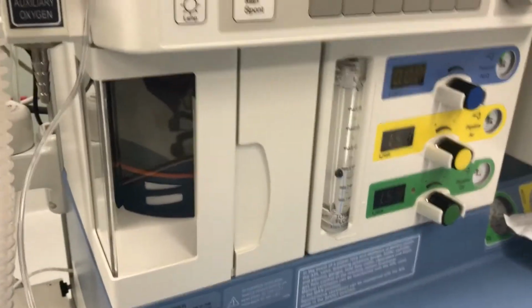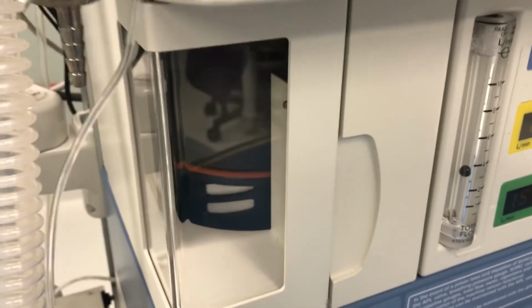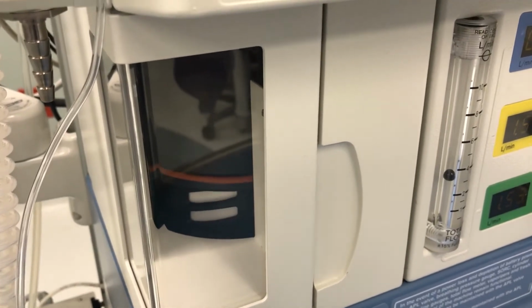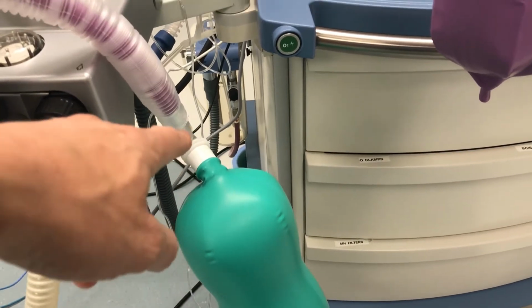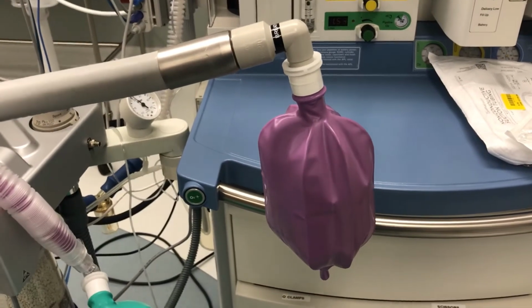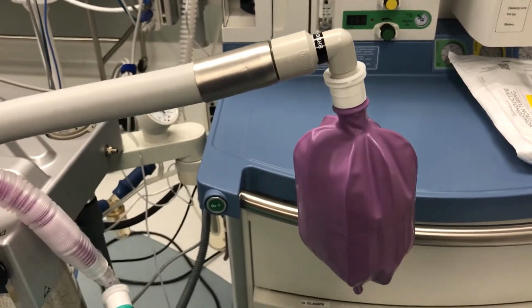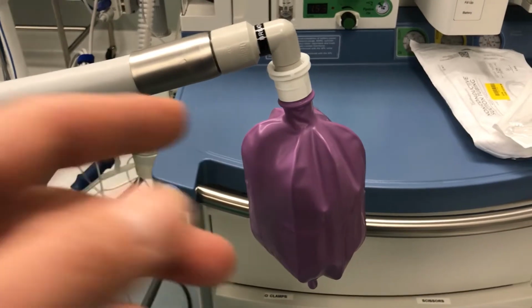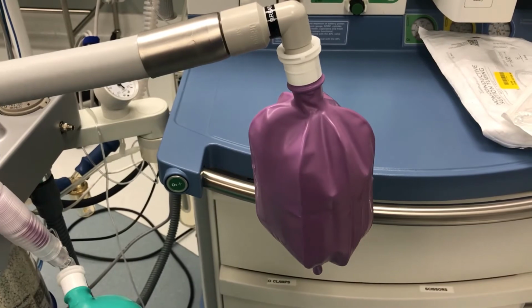This machine's mechanical ventilation is driven by a piston-powered bellows, as opposed to the machines at Hedrick, which are driven by oxygen and actually have quite a bit higher oxygen consumption. Also, I'm using this bag as the artificial lung. I saved from using the filter here. But notice that even though we're on mechanical ventilation back here, the bag moves just to demonstrate how fast the ventilator is breathing and the relative indicator of depth. It is only just an additional tactile monitor. It's not actually necessary and part of the system.